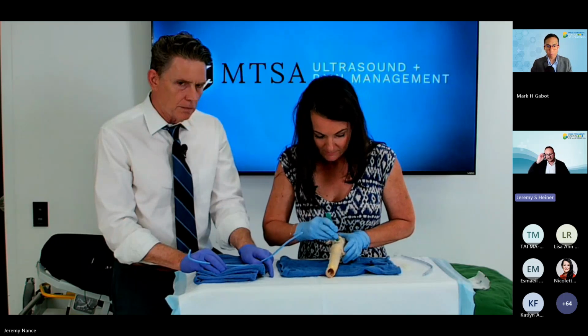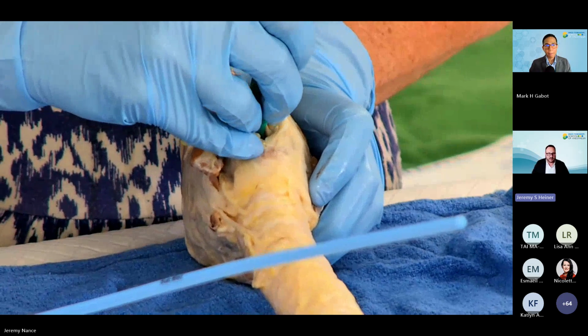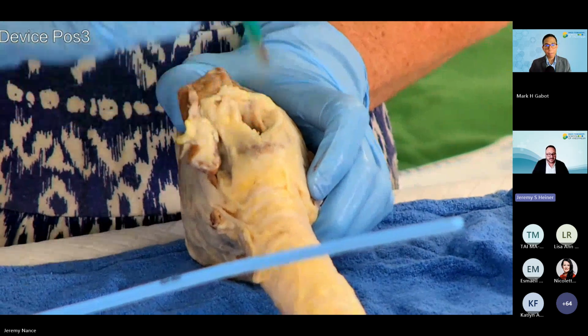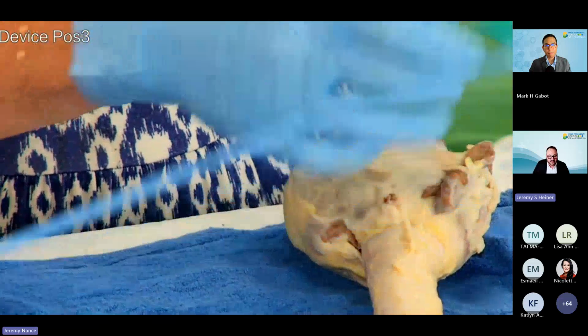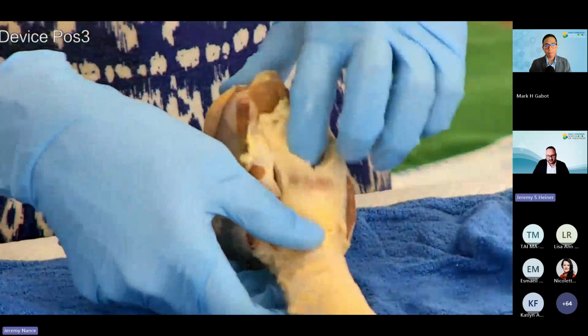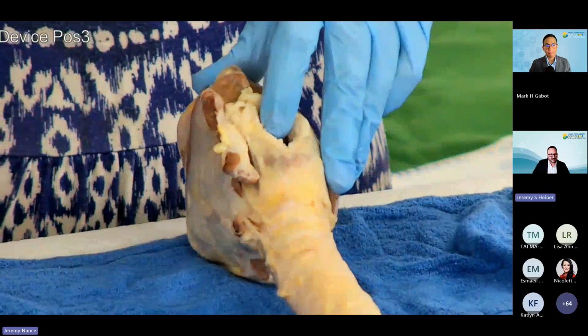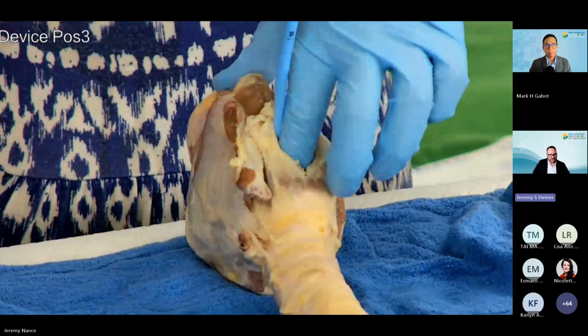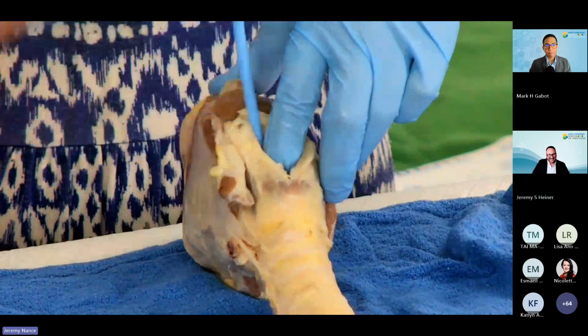When we practice this technique, we've practiced it in the past at the AANA conference and at other state conferences, and participants have not all gotten all the way through, which is a great piece of learning. I think I'm hitting something. You're getting your finger all the way in there. That bougie's got to fit. I know. I think I'm hitting something.